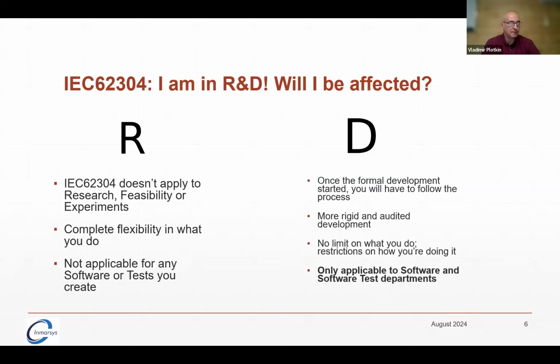Another question which frequently comes up is, say, electronics engineers or mechanical engineers, does it regulate them? No, it does not. This standard is specific for software and software test departments. No other departments are involved. On the electronics side, they have other standards like 60601 or 61010. On the mechanical side, they have their own standards, but this specific standard is for software developers only.